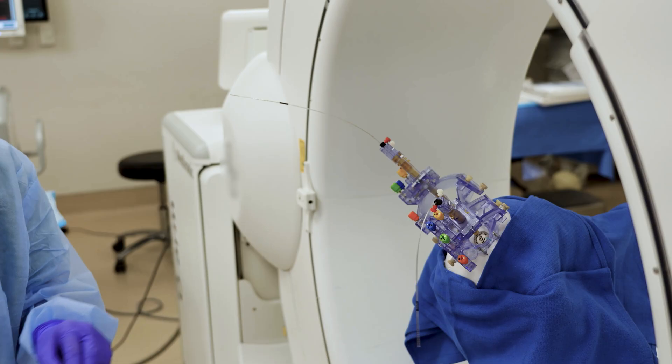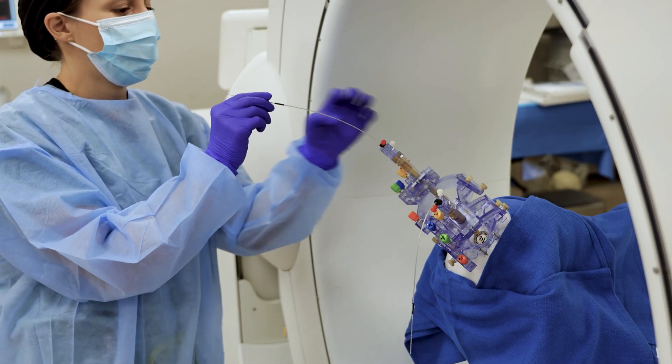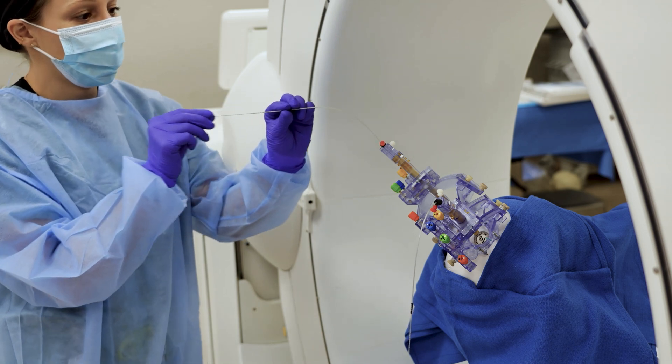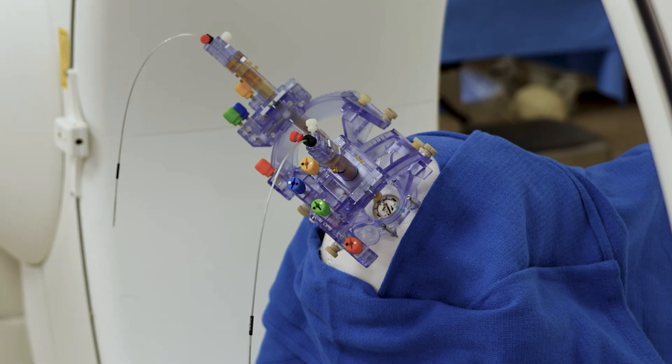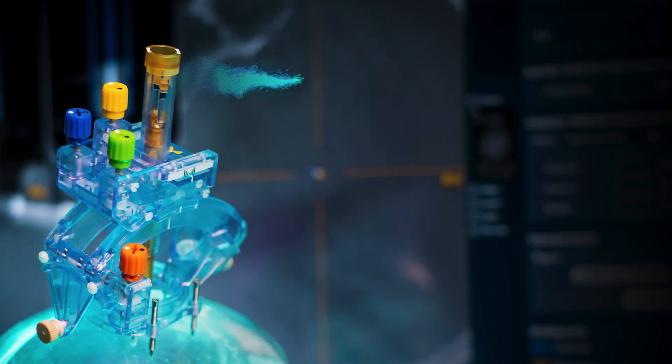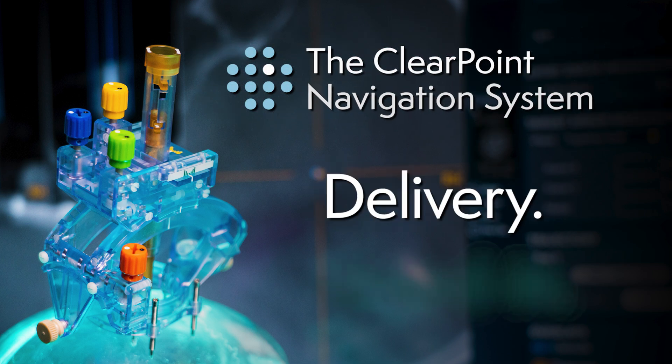The new ICT guidance option provides a practical and more widely accessible complement to MRI guidance. Early clinical results highlight an efficient workflow with bilateral simultaneous pin-to-insertion time below two hours on average. The ClearPoint navigation system: Delivery. Dialed in.